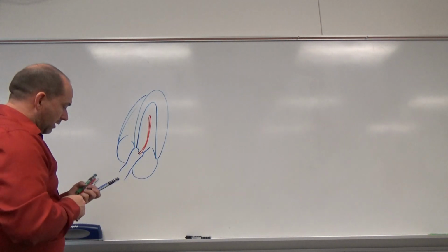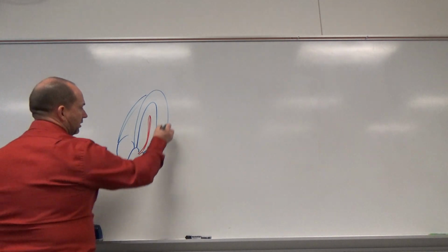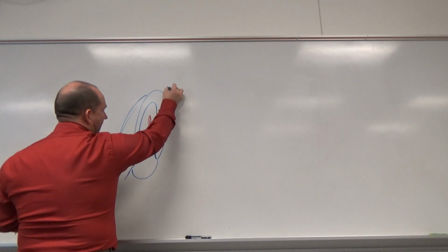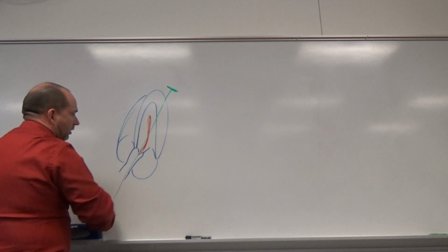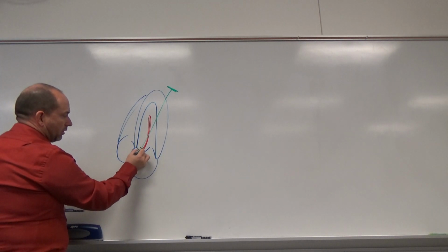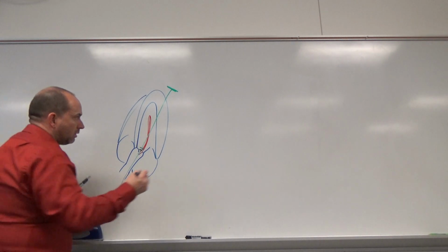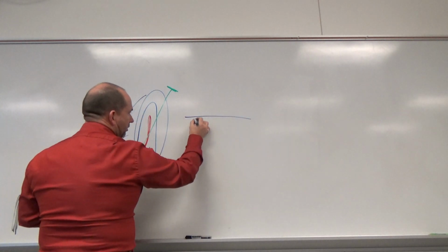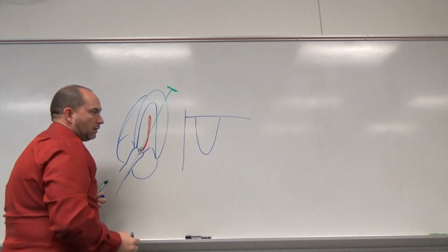So we want to get lined up to the best angle possible. So we've angled and tipped forward anteriorly a little bit. Now we're going to come a little bit lateral again with our transducer so that we can get a nice straight line through the middle of that valve. The first Doppler we're going to take is in the LVOT, left ventricular outflow tract. We're going to bring our baseline near the top, and we're looking for kind of a parabolic.